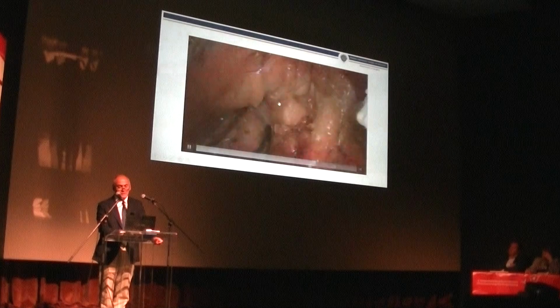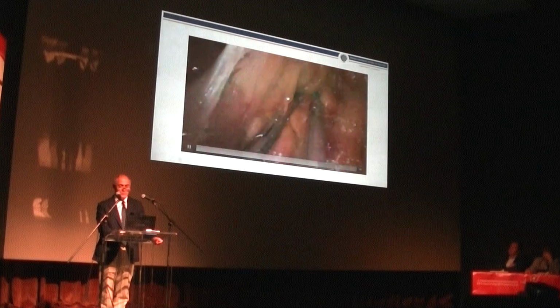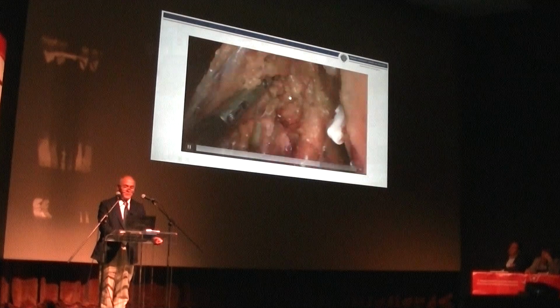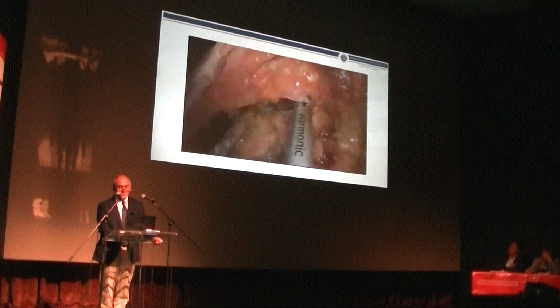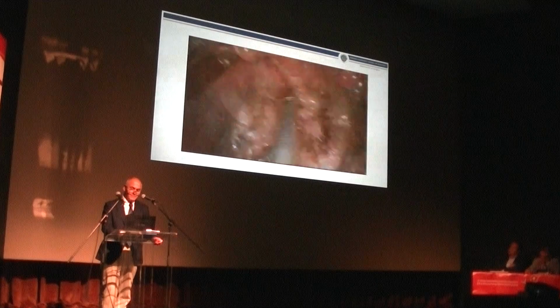So we could see the bursa omentalis from the superior border of the pancreas and the inferior border of the mesocolon. Yeah, here is the bursa omentalis. You could put a swab in order to make things easy from the other side.